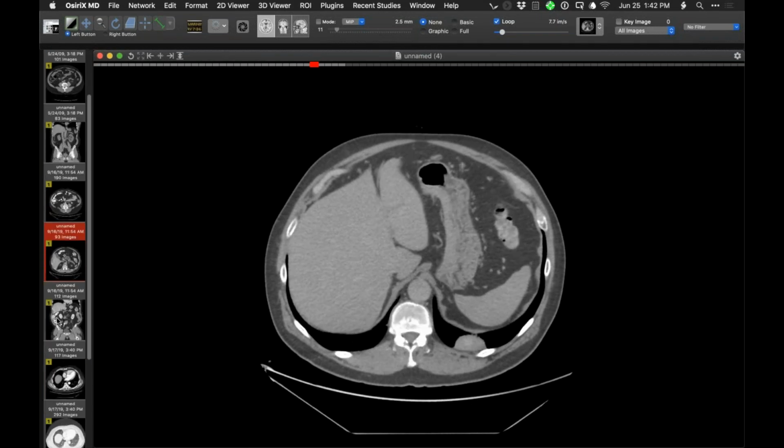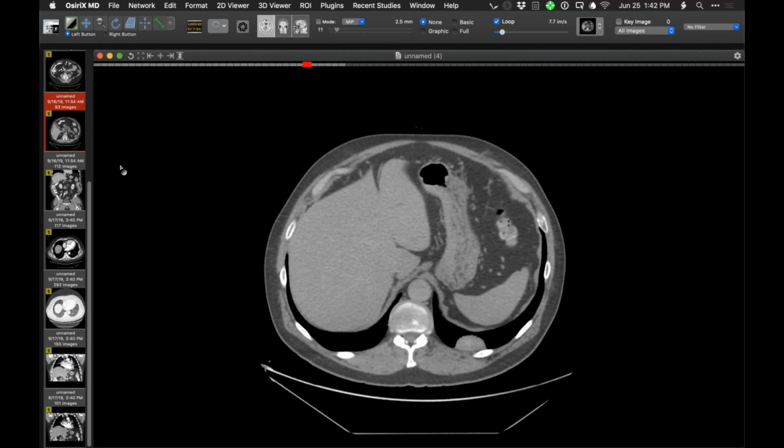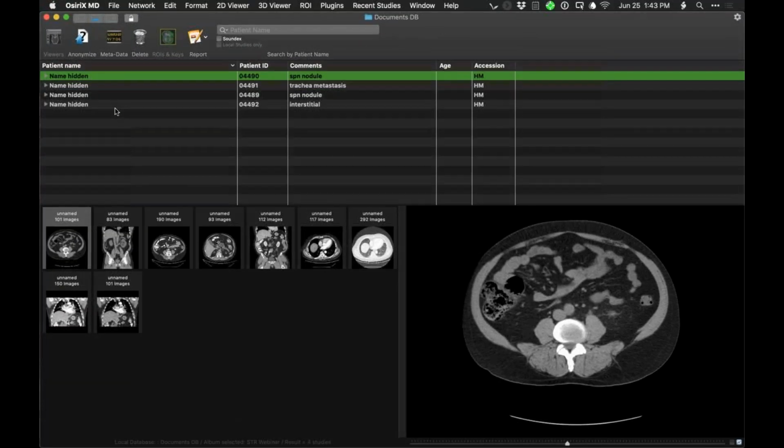And there's a differential diagnosis for that, but I would suspect that most of us would probably pick a solitary fibrous tumor of pleura as the most likely diagnosis. And this was removed, and that's exactly what it is. So it is a fibrous tumor, and typically now the pathologist will stain this for STAT6, which is the preferred, I forget what it stands for now. And typically they're positive quite readily for STAT6, solitary fibrous tumors.